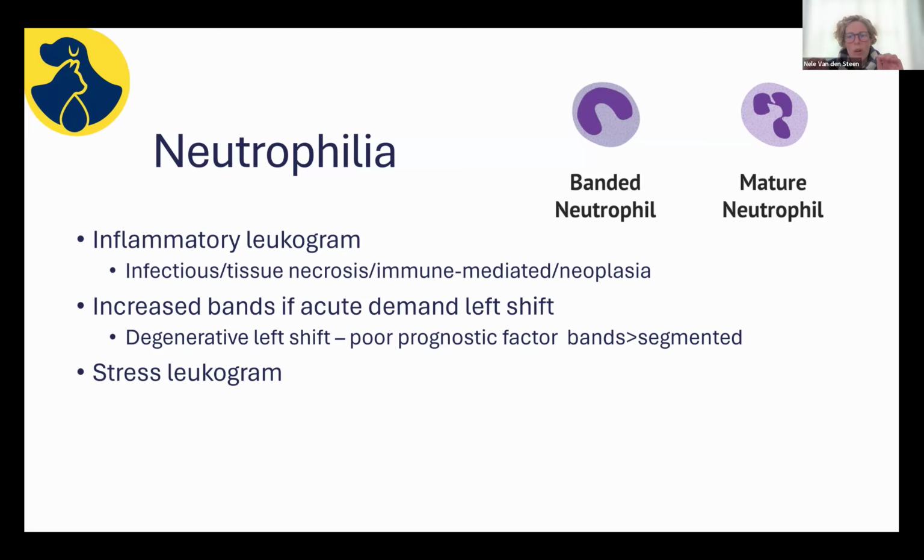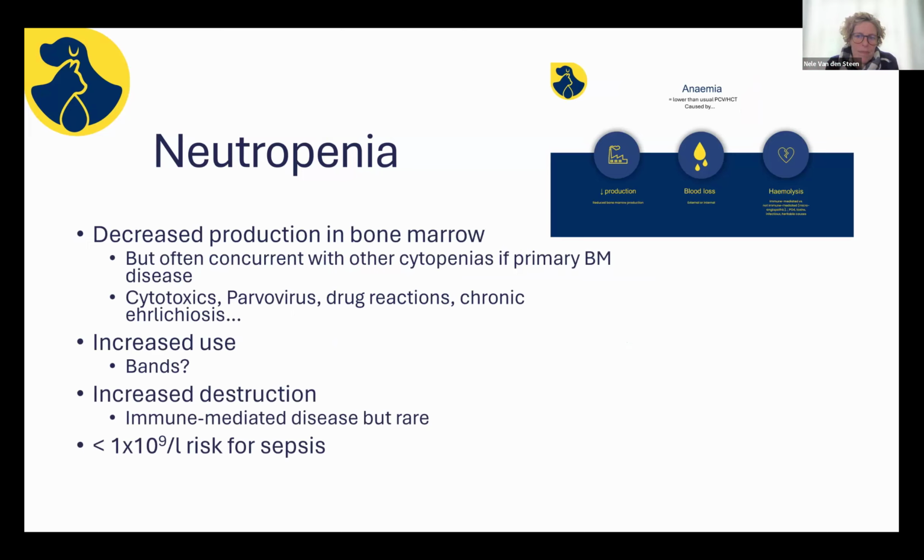Okay. You will also get it in patients that are quite stressed. So you will get a stress leukogram, and I've put the algorithms at the bottom of this anyway to talk through so we can compare those.